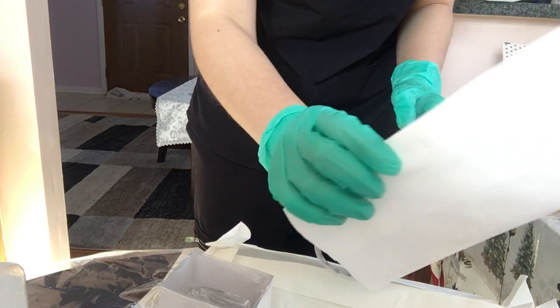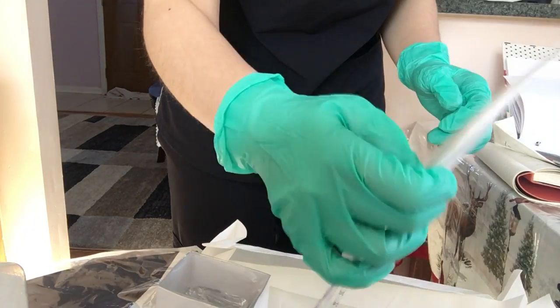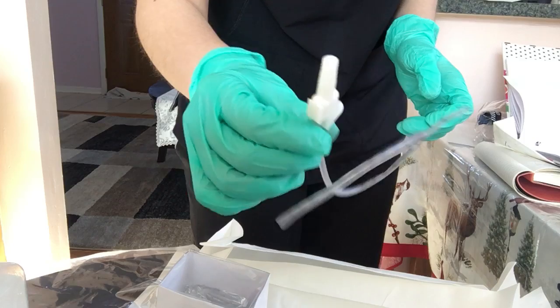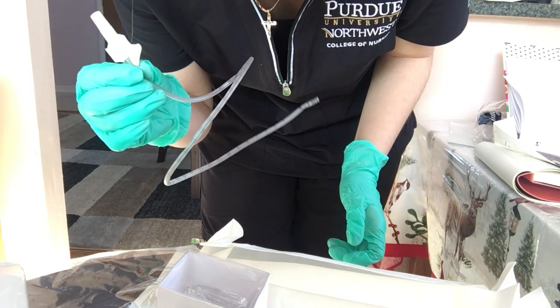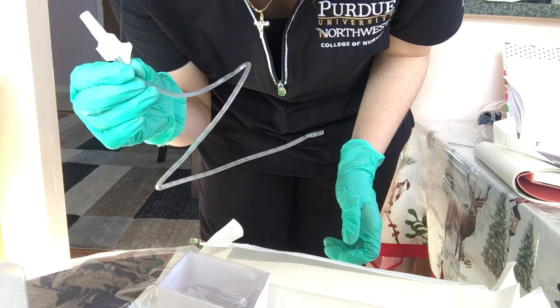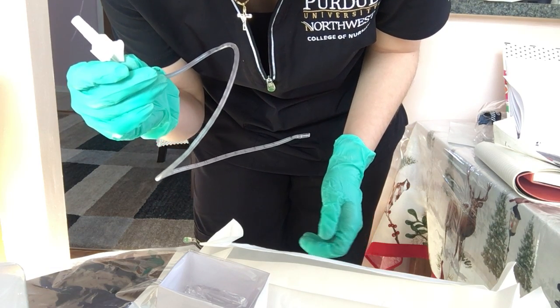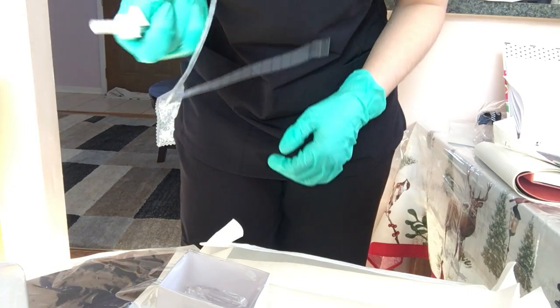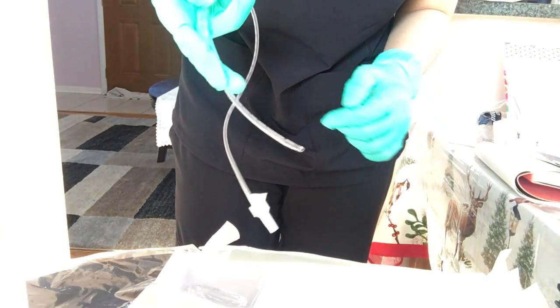Okay, and we're going to first drop it onto our sterile field and pick it up with our dominant hand. And then we are going to moisten the catheter by dipping it into the container of sterile saline. So I'm just going to place it down. I picked it up with the wrong hand. Okay, so we are going to now moisten the catheter.